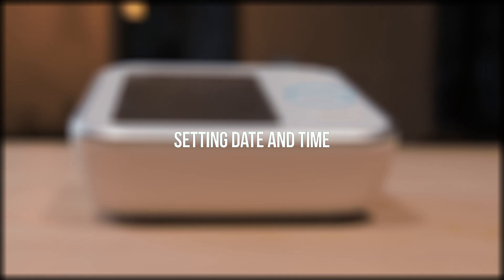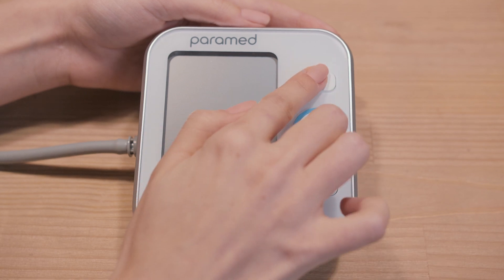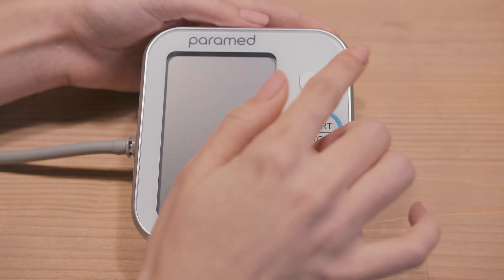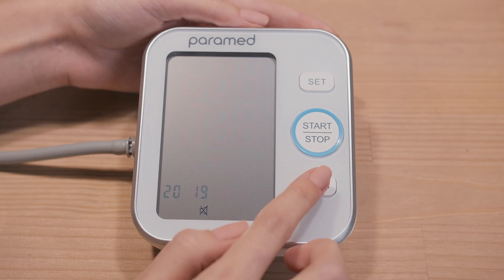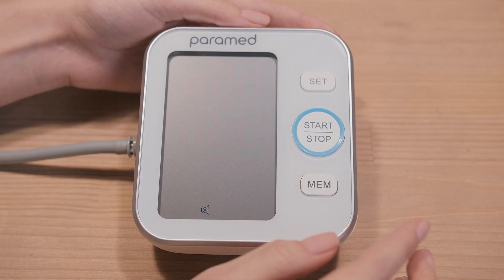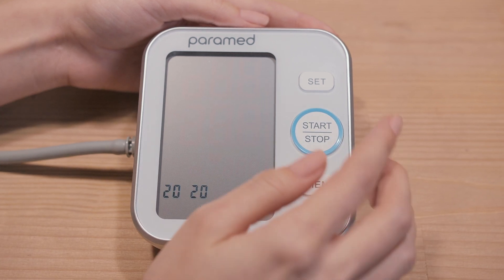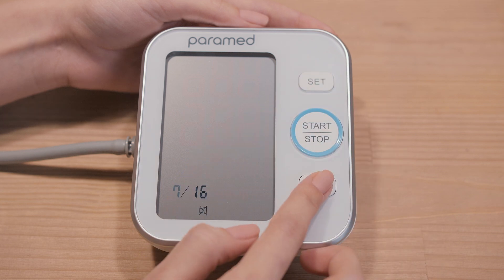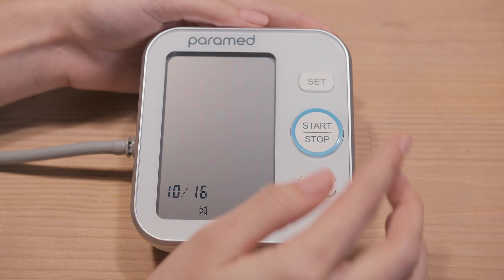3. Setting Date and Time. While the screen is off, press the Set button for more than 3 seconds. Press Set several times until the date and time symbols appear. To change the year, press the MEM button. After each click on MEM, the date will change by one unit. To change the month and date, press Set again and use MEM to choose the needed value. To save, press Set and then the Off button.